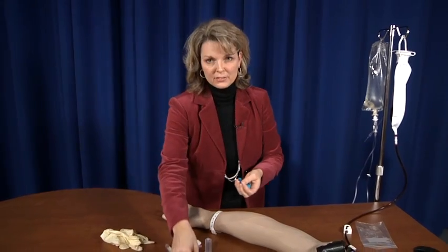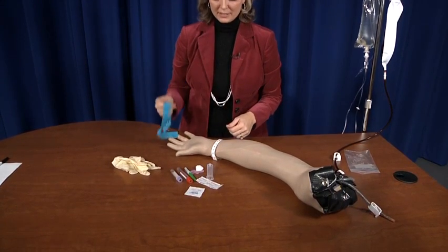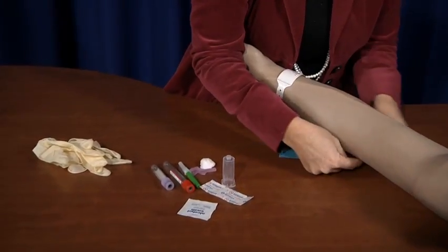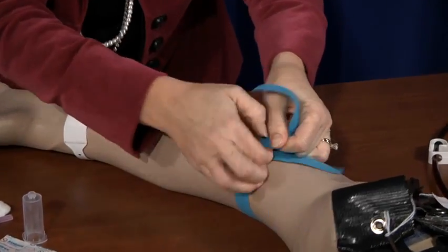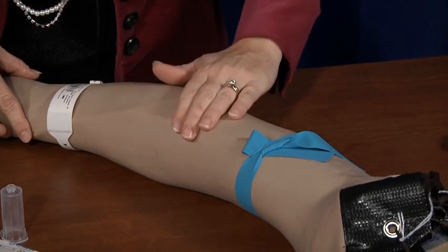All right, we've got labs ordered from the physician, so now we are going to draw some blood. And we've got our equipment in the proper tubes that we need for those particular labs. We're going to go in, introduce ourselves, let the patient know what we're about to do, answer any questions that they have. Make sure you've got the right patient. Always do your patient identifiers, the 2 identifiers. We're going to assess for a good vein. So we're going to put our tourniquet on. Again, cross and tuck. We'll use the antecubital veins, and you see he's got a big one here.